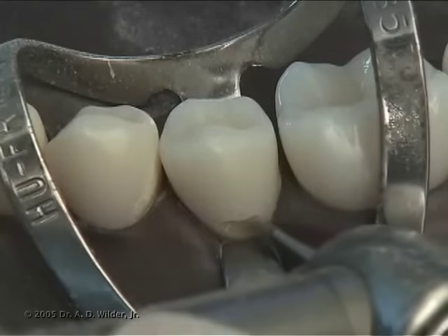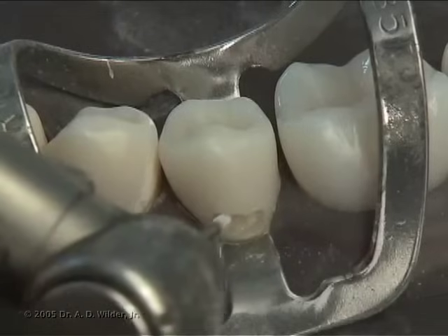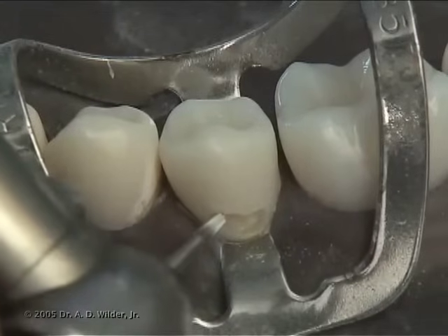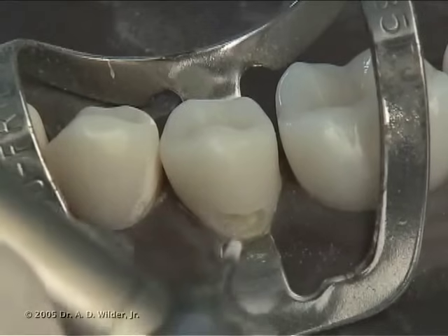Extend into dentin only if the defect or caries calls for it. Be sure to create divergent walls, which will naturally result from the shape of the tapered fissure burr.